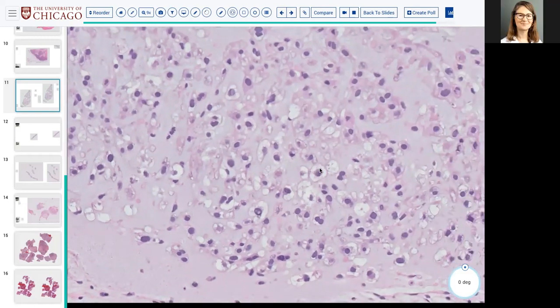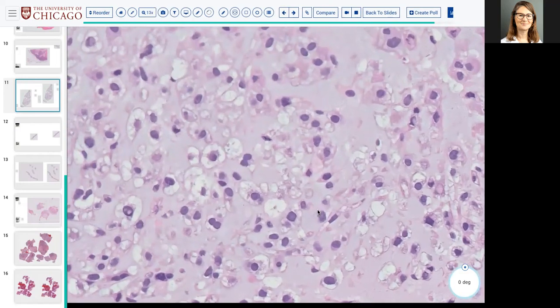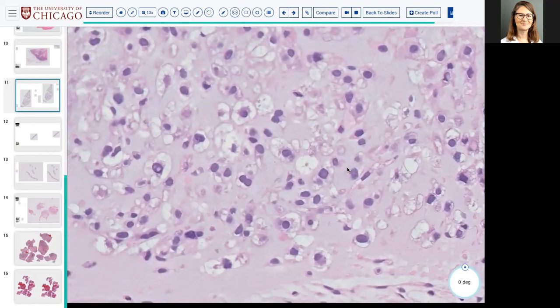Okay, so if you want to think about myxoid liposarcoma and you think that these vacuoles are fat vacuoles that might make up a lipoblast, do these fit the morphology of lipoblasts? You want an indented nucleus that's being squashed by the fat vacuoles, or even a triangular, pyramidal sort of nuclear shape.